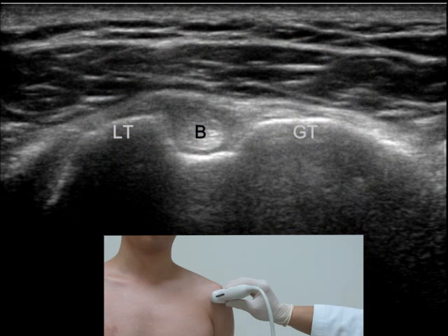Ultrasound of the shoulder begins with the long head of the biceps tendon, which is a reference landmark. When we place the transducer in the horizontal position, the biceps tendon can be found as a rounded echogenic structure between the greater and lesser tuberosity.